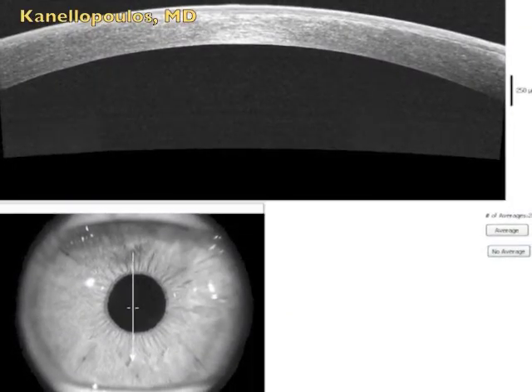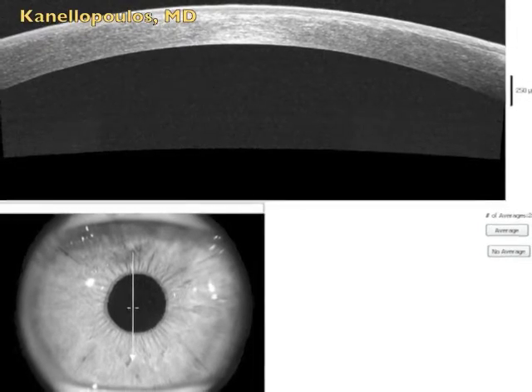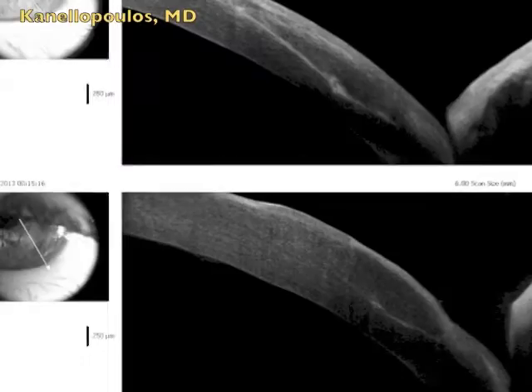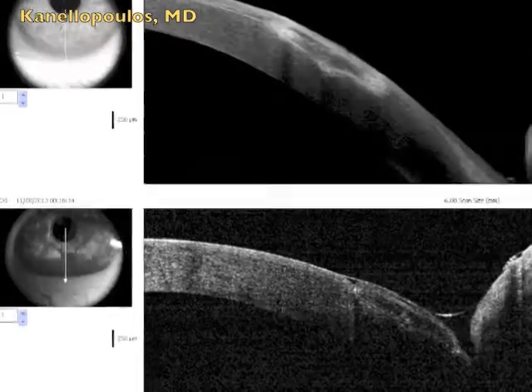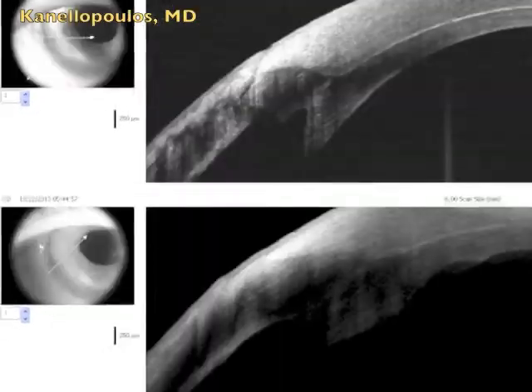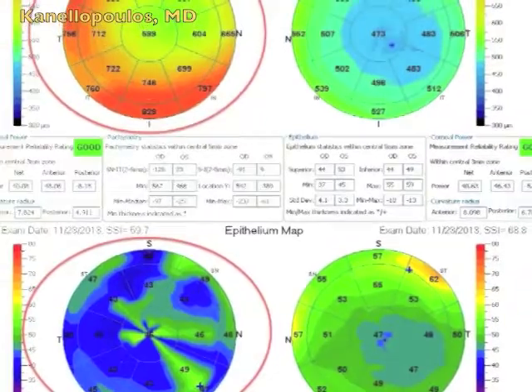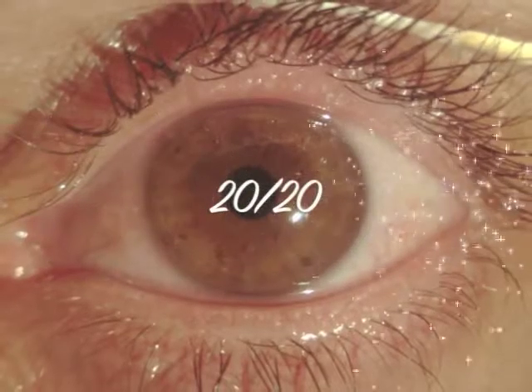The OCT images at one month show the flap looks perfect — it has really leveled out, giving extremely good vision. Comparing the OCT from the day after surgery to just before suture removal one month later, you can see how the swelling has resolved. There is also an OCT image showing the epithelium has normalized. This is the final result: 20/20 vision. Excellent result.